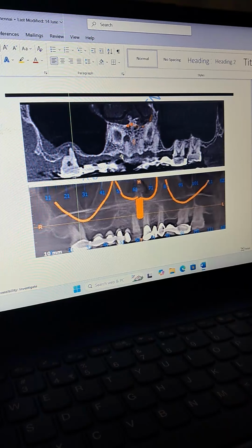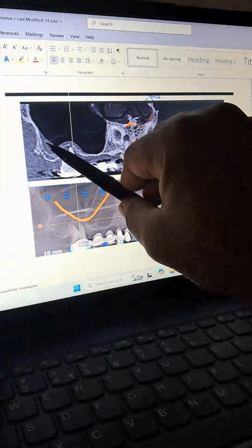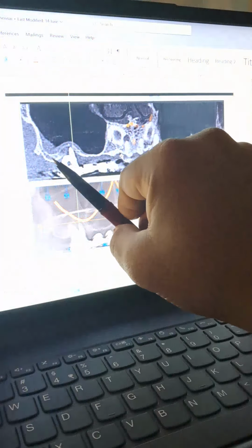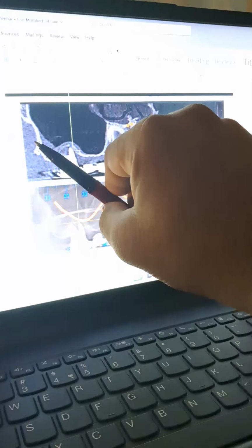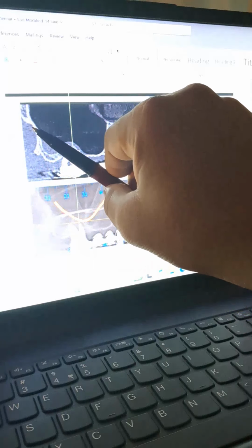If it's tilted, invariably its occlusal load transfer capacity will be less than an implant placed straight in the same quality of bone. For this case, the first pterygoid should be from the tuberosity area, distal to the second molar, at this particular angulation, and the second pterygoid will always be transsinus.